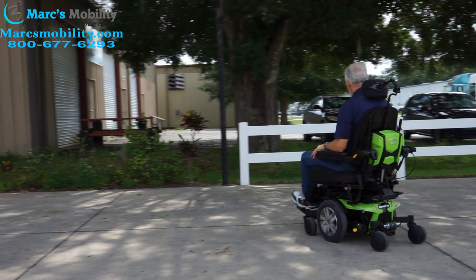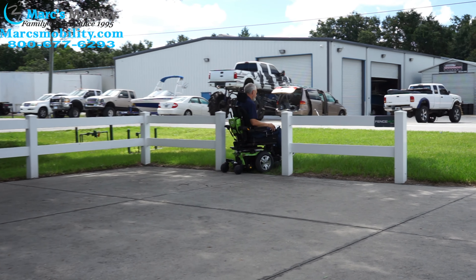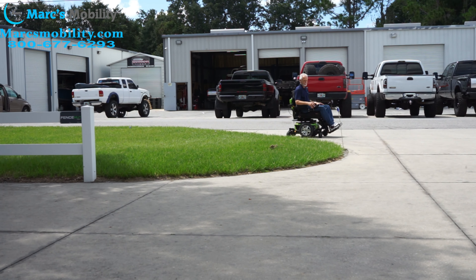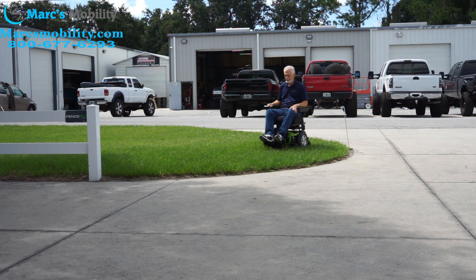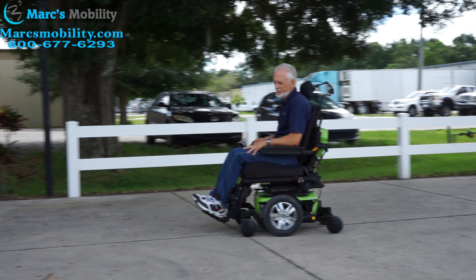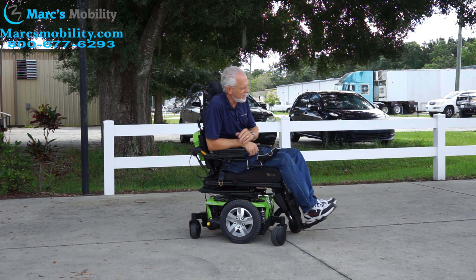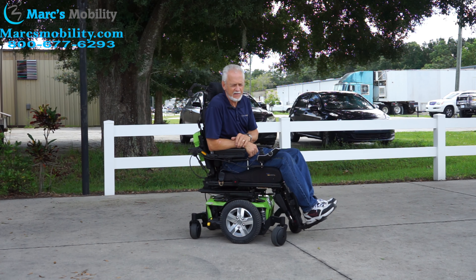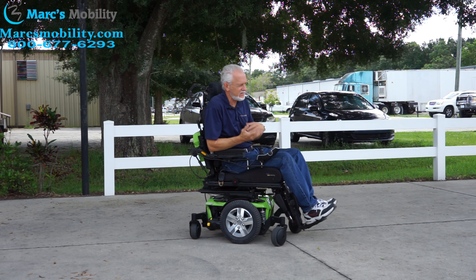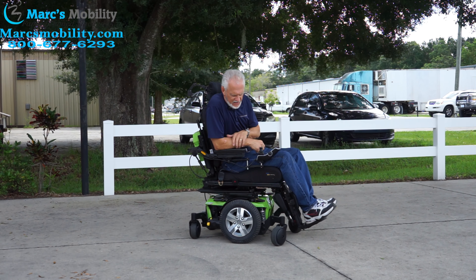Very easy to drive. Quantum Edge 2.0 neon green — tilt, reclining legs — no problem in my grass. My grass is pretty decent, so in my grass it has no problem. Great suspension — it's a little bumpy in my grass, my grass is really bumpy, but it had no problem.